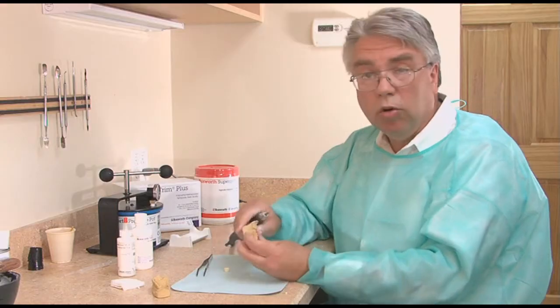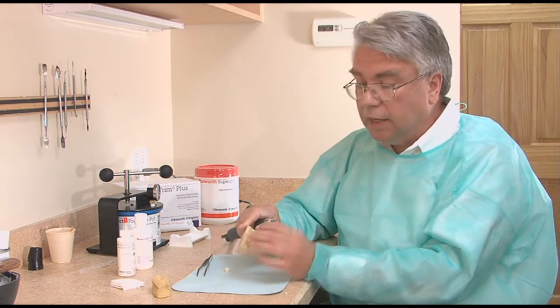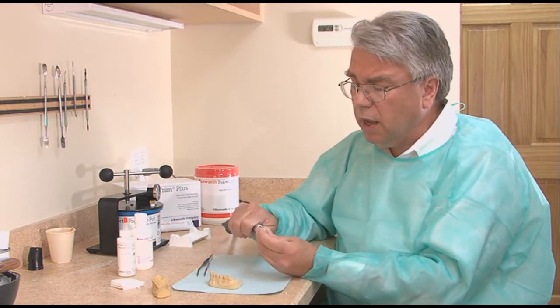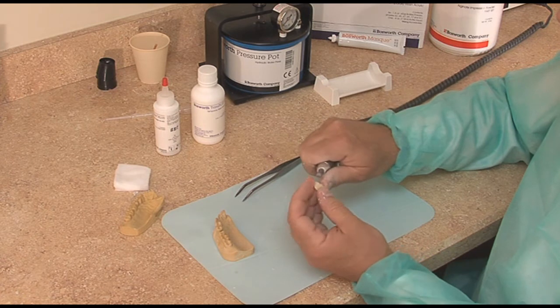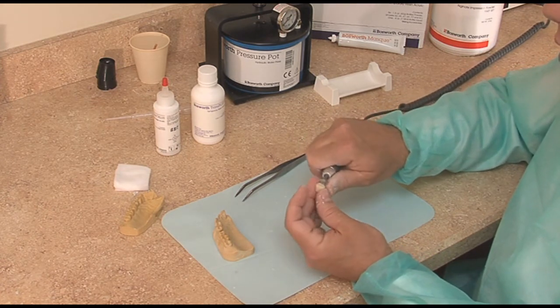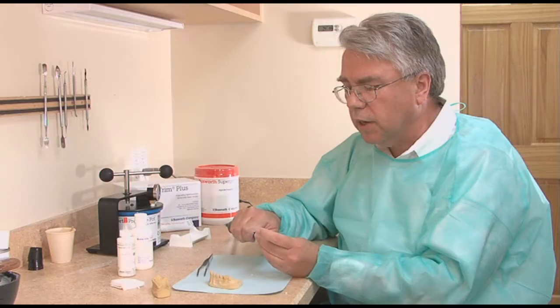Now if this tooth is a core buildup or hasn't been built up with amalgam or composite and it's kind of more of a lump, I may spend a little time to accentuate this temporary crown. I may try to put in a little better grooves, a little better anatomy. Your patient is paying a nice price for their crown — give them something they can appreciate even if it's just a temporary.